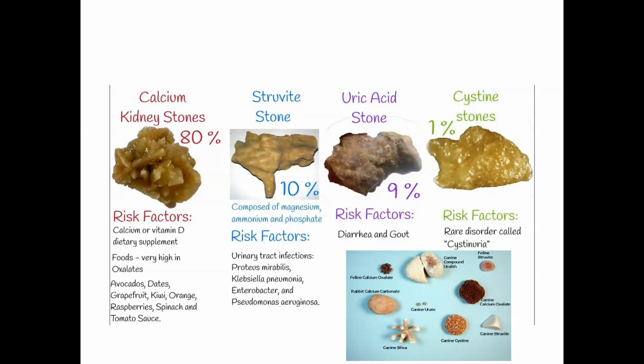So by far the majority of renal stones are radiopaque. That is why you ask for an X-ray. Okay, got an idea now? But all these will be visible on ultrasound. Why? Because ultrasound is just sound waves. So anything which is going to hinder the sound wave, and obviously any stone is a firm, hard structure, is going to reflect the sound waves. Even if it is made of cholesterol or whatever material, it's going to reflect the sound waves. So they'll appear on ultrasound. Got an idea? Basic idea?